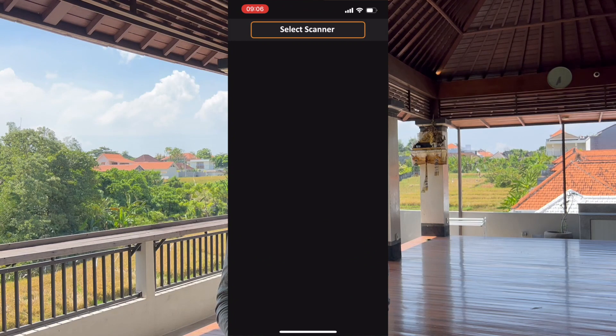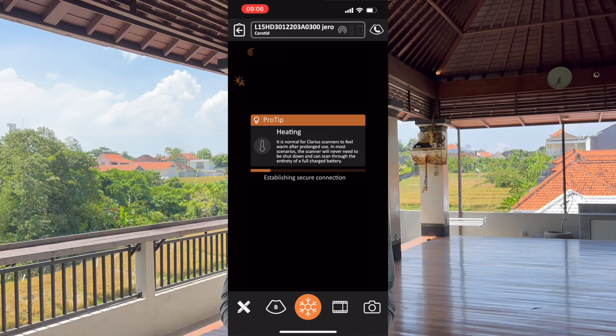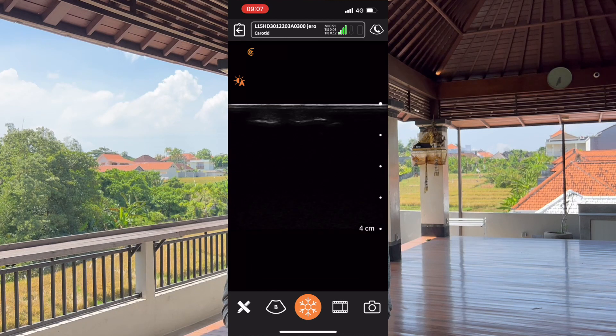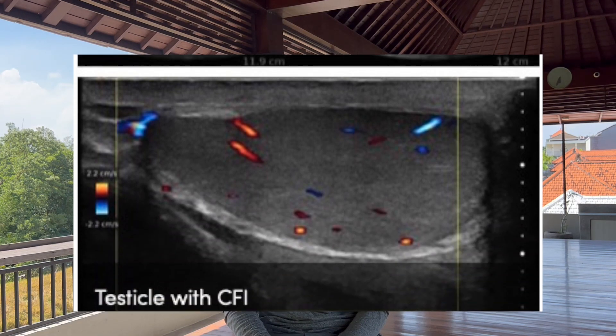Regarding the software, the app is free and available on both the Apple App Store and Google Play Store. It has a demo mode so you can try it even if you don't have a Clarius device yet, just to see the settings and how it would look in real life. Bear in mind the stock images in the demo may have super quality, and real life can be kind of disappointing — so take those images with a grain of salt.